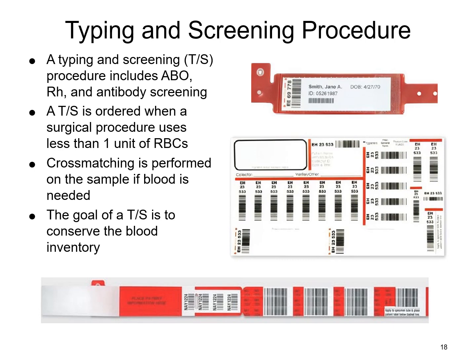But I just kind of want to mention these blood bank bracelets. So when you're doing a type and screen for the potential of a cross match, you're going to include some kind of bracelet. Now, I've seen a variety of bracelets that look different as far as how they're manufactured or made. Most bracelets will look something like this one down here at the bottom.